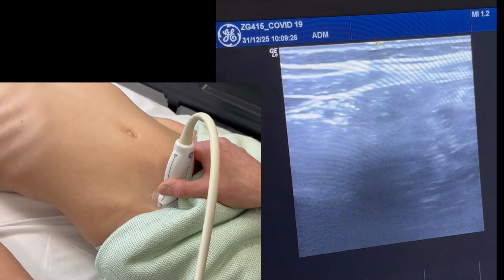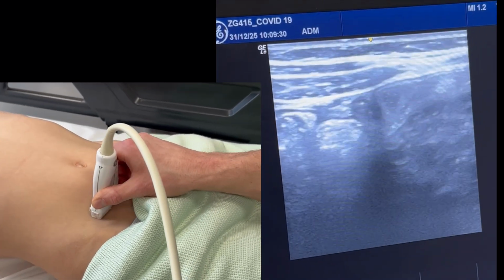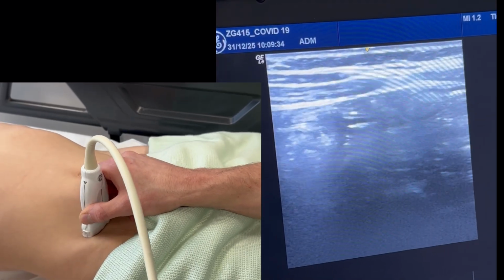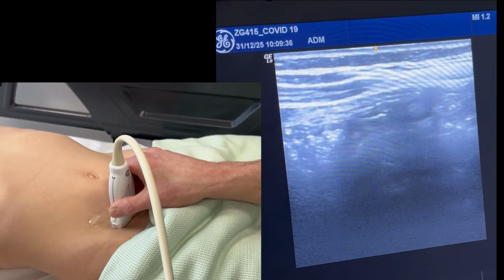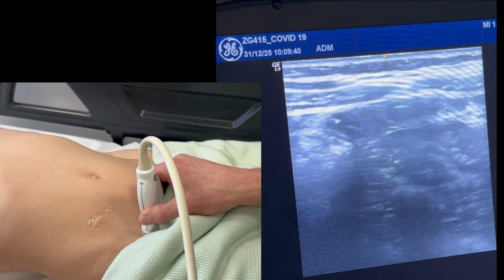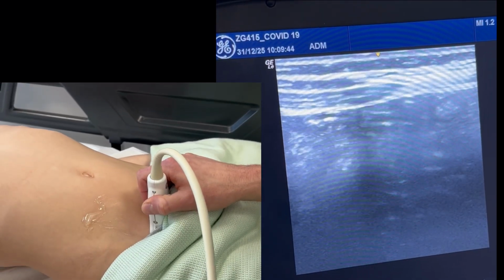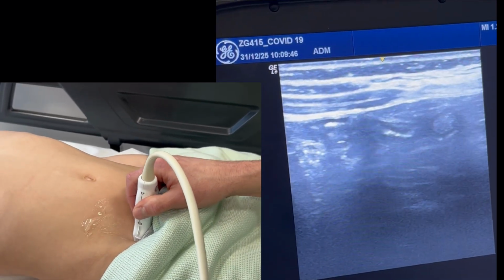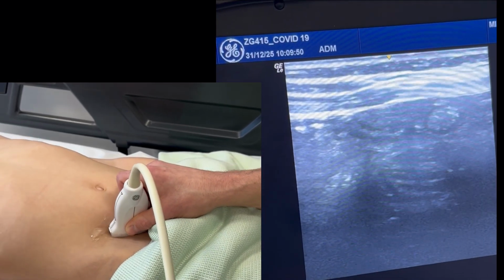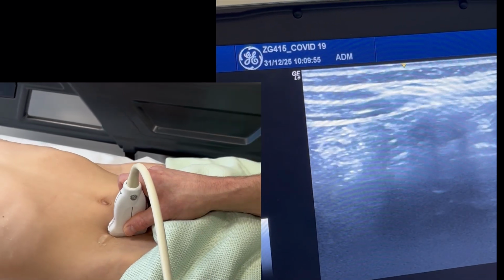I'm in that kind of lower pelvic region, which is somewhere where I tend to start. I found a lot of pelvic appendicitis projecting downwards. And you can see there on the right of the screen, we can see the circular structure, which really doesn't move, it doesn't change shape. We've got the peristalsing loops of bowel next to it. But if you keep your eyes trained on that very, very circular tubular structure, we can see that that's the appendix.